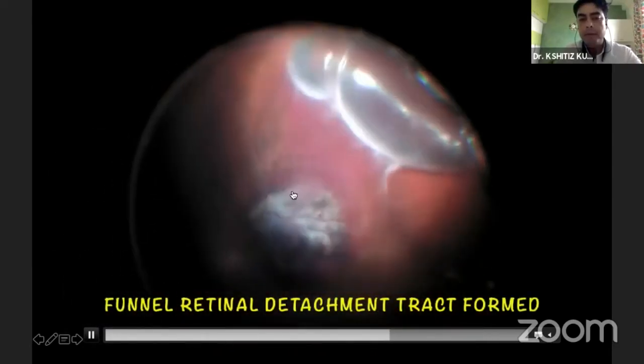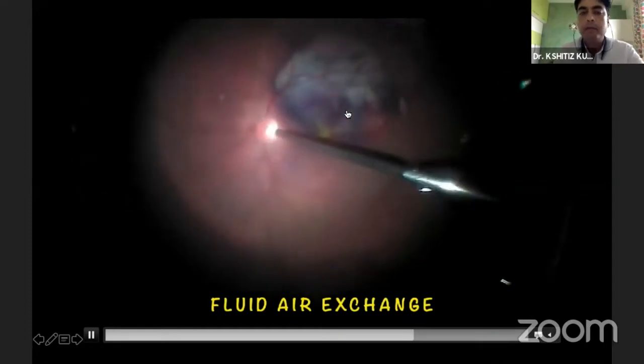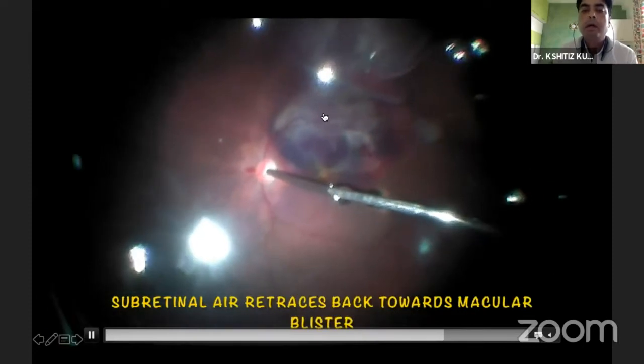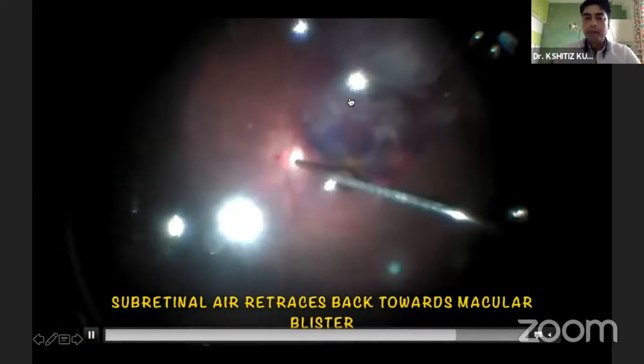This probably happened because the sub-RPE mound was so tight that it did not allow the air to collect below the macula, and hence the air followed the path of least resistance towards the periphery as well as regurgitated out. So I did not know what to do, so I just started with the fluid exchange, and thankfully the air retraced back towards the macula so that we could achieve a subretinal pneumatic displacement.